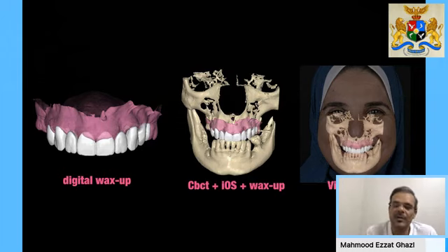And then later on, we started to find that functionally this would be great, biologically this would be excellent, but that didn't mean that it would look good aesthetically for the patient, because this is one of the most important things why our patients are restoring teeth. At the end, what they really understand is how this restoration is going to look. Does it look good or not? Because most patients are always looking for social acceptance. So then we started to understand that we have to also put in an aesthetic proposal, meaning that it's not just according to the function and the biology of the crown or the restoration that we're doing. We also need to put aesthetics in mind.